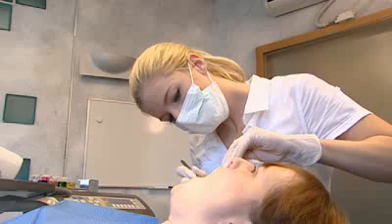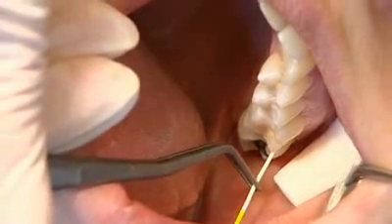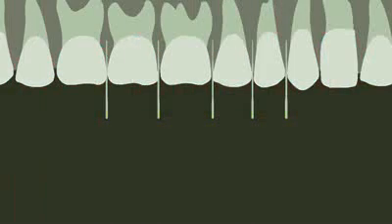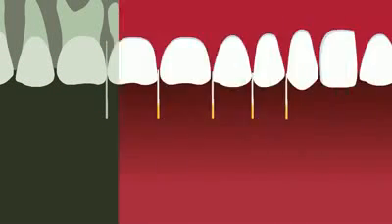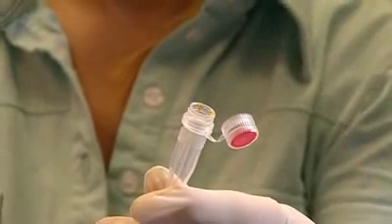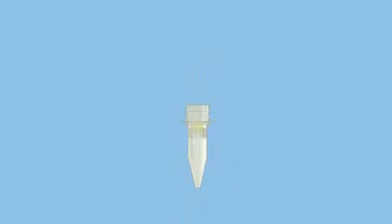If you wish to determine the presence of PA bacteria in the entire periodontium, independent of the location of the bacteria, a pool specimen is recommended. In this case, specimens are taken from the deepest gingival pockets of each quadrant. Up to 5 paper points can be combined together in the transport tube with the red end cap.